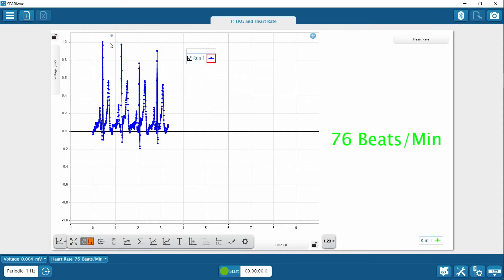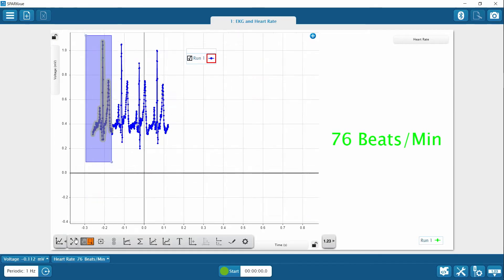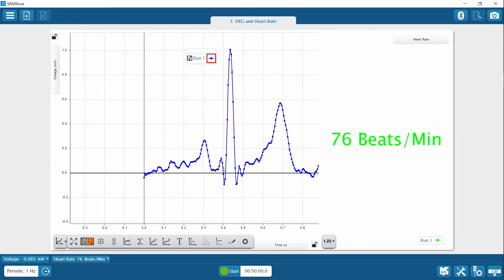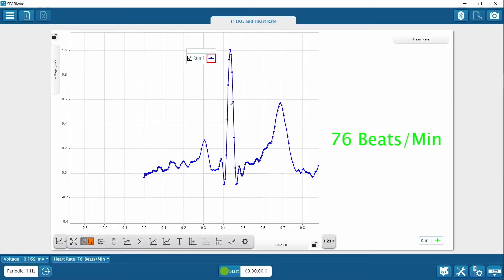Let's zoom in on one heartbeat. Here is the beginning of one cardiac cycle, known as the P wave. The P wave begins to form when an electrical current is generated at the SA node, or pacemaker, and is passed along to the atria. The atria begin to contract during the P wave and pump blood towards the ventricles. This downward pulse is the Q wave, which indicates the electrical signal has reached the AV node and the ventricles have begun to contract. The electrical signal is strongest at the R wave because the main mass of the ventricles are contracting.